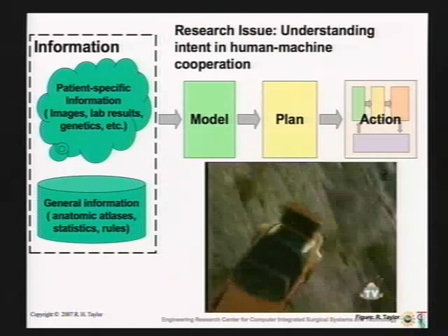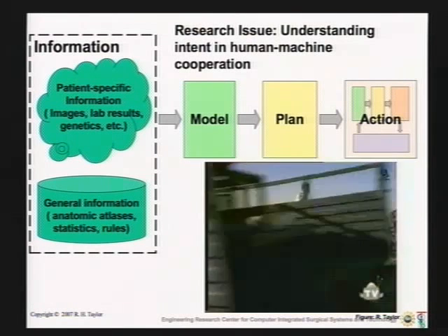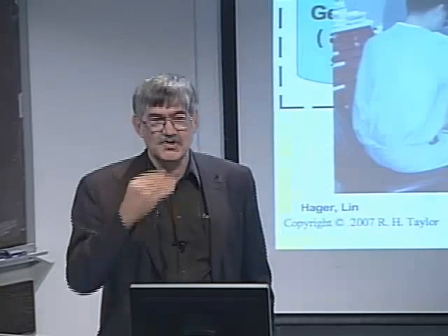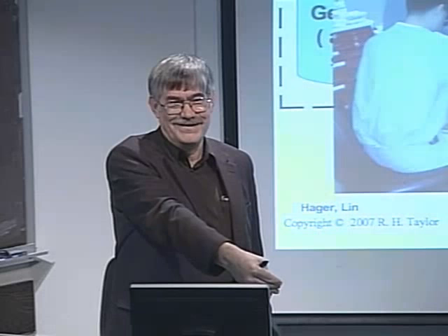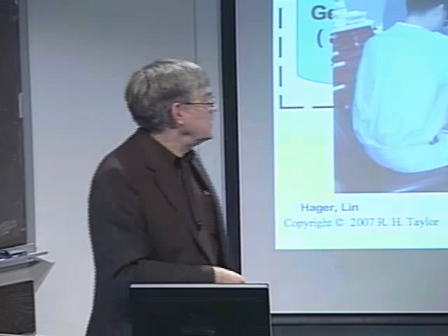So this is the surgeon's worst nightmare about a surgical robot. And it's humorous, but it does make a good point. If you're going to assist a surgeon, you both need to know what the limits of what you're doing are, and it's also really important to be able to interpret what the surgeon is doing, so the assistance you provide is appropriate. And here's some work.